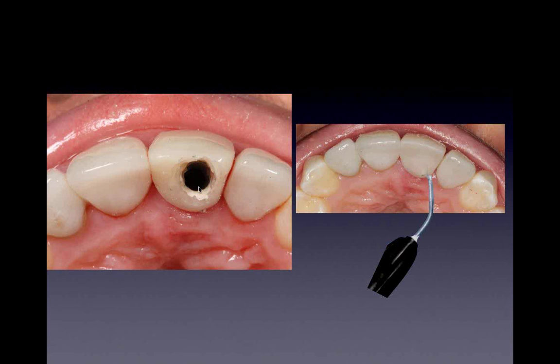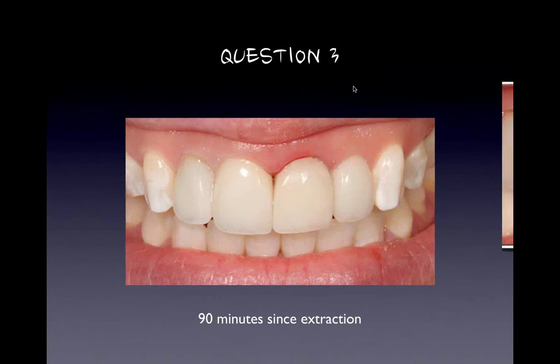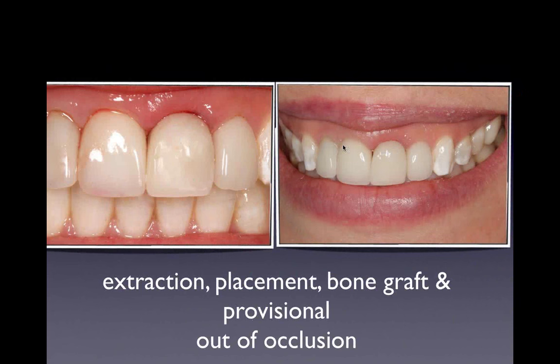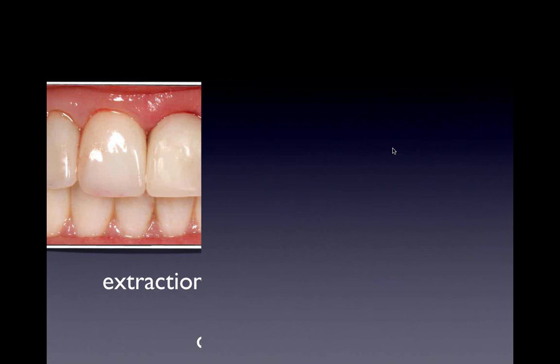The great thing about this technique is sometimes your implant will come out on the facial. So the great thing about these flowables, you can actually close it from the facial and it'll really mask it really well with the composite. So it doesn't matter where your access hole is. You just got to go back in and access that when you're ready to go. So the great thing that happens here is extraction, placement, bone graft, provisional, out of occlusion. Here's your provisional. Here it is the next day. It's 24 hours later.